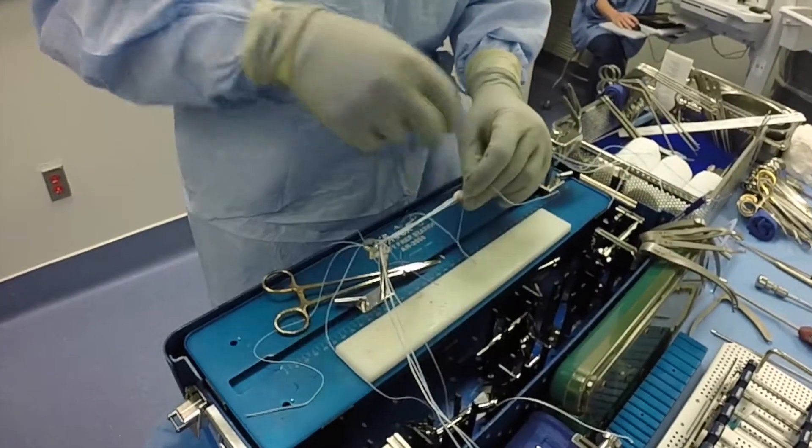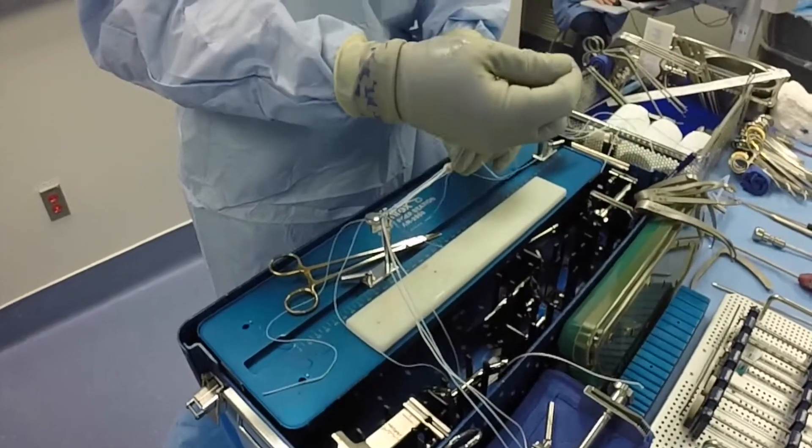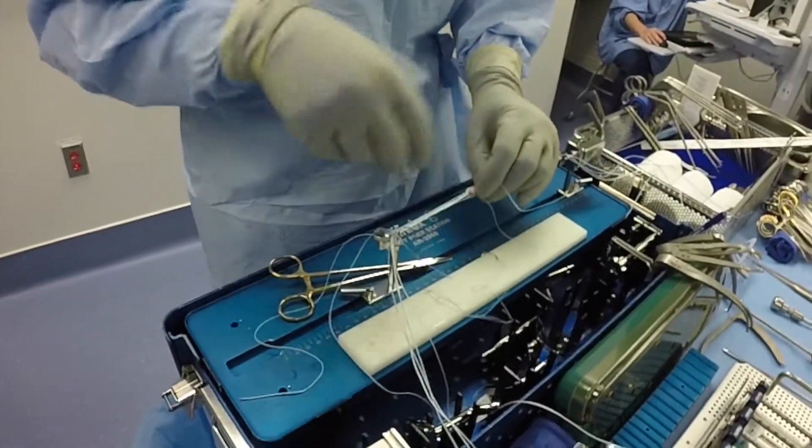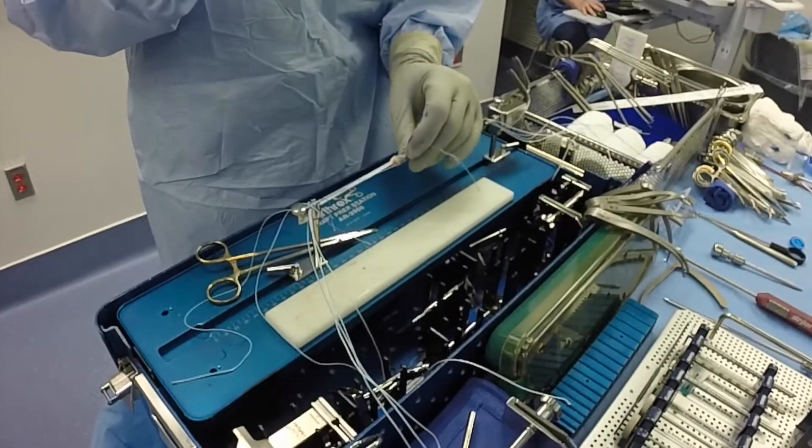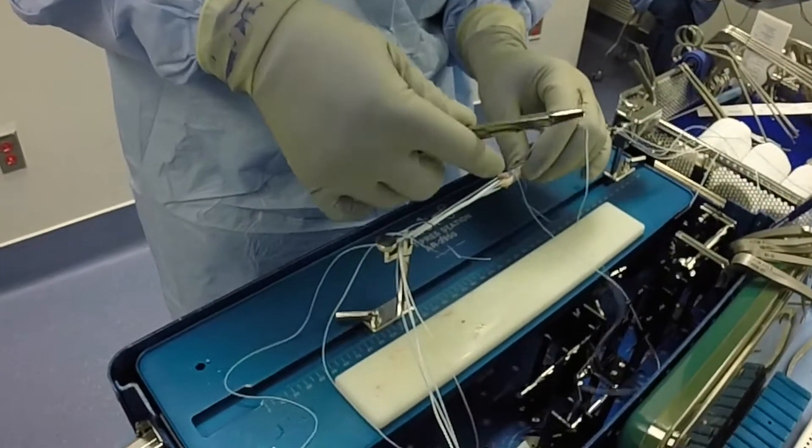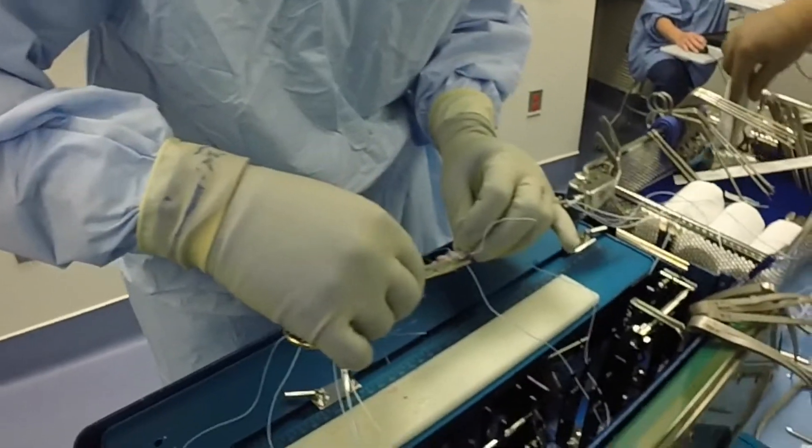One at each end of the graft, approximately 15mm from each end, and care is taken to not catch the internal brace sutures and to bury the knots within the central portion of the graft.